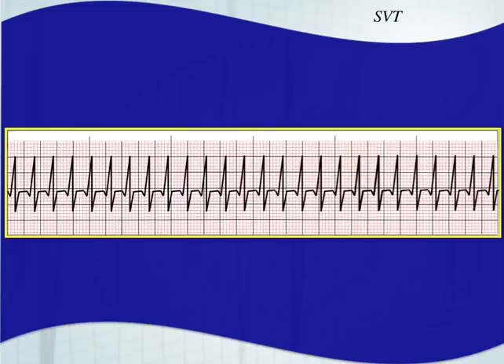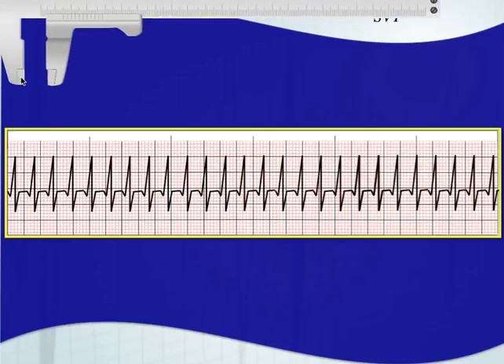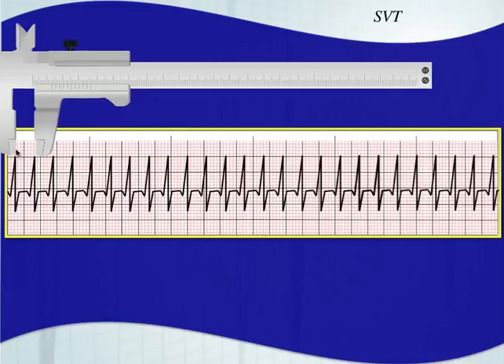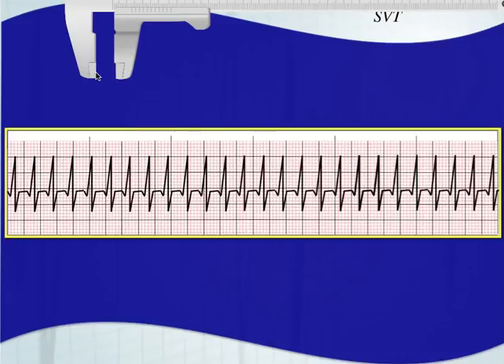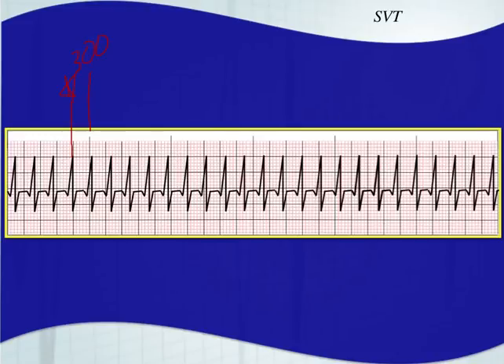Here's an example of SVT — notice you don't see any P waves, it's very fast, and it is extremely regular. Using the big box 300 rule, if you find a QRS complex on a bold line, the next bold line would be 300 beats per minute, and the one after that would be 150. Since this QRS falls between those, it's getting close to 300 but not quite there.